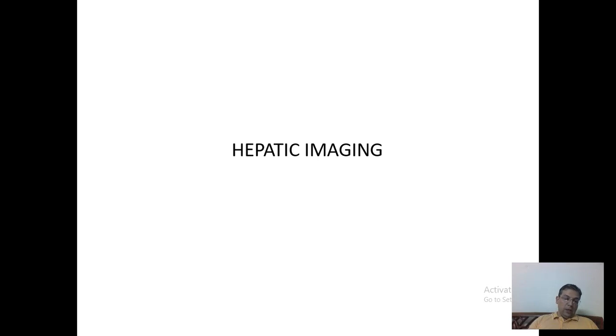that person has. Now, as we know, when we do an ultrasound, you must have seen a probe. The probe is the thing that you put on the patient's abdomen and then you get images on your machine. Now that probe has piezoelectric crystals, which when the electric current passes through them, vibrate at a specific frequency which can be controlled, and that frequency of course cannot be heard by ourselves, and that is why it is known as an ultrasound. Now that probe sends these sound waves which pass through the organ, and then the reflection of those sound waves gives the image that is displayed on the screen. Now it is a real-time investigation, and because it is real-time, the operator has to interpret whatever it shows.